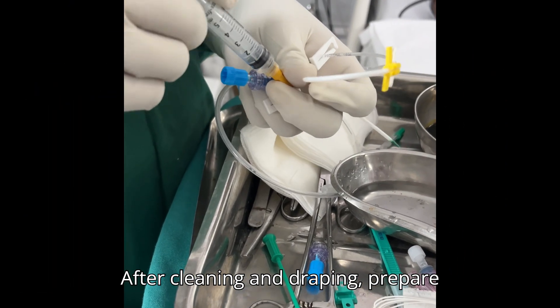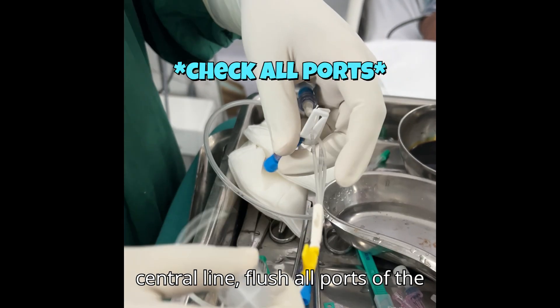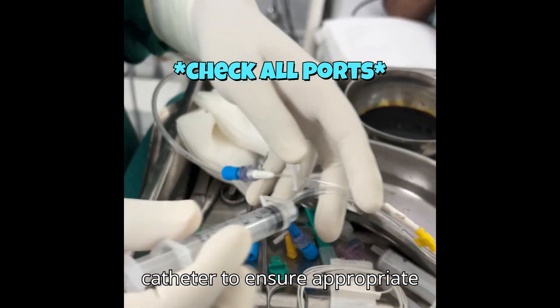After cleaning and draping, prepare the central line and flush all ports of the catheter to ensure appropriate functioning.